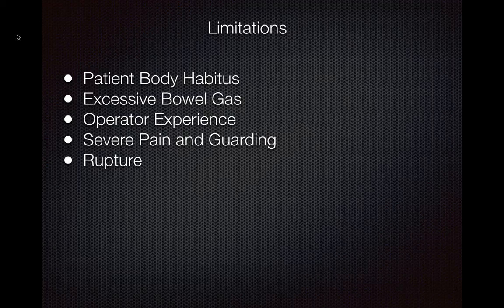And also, it is known that ultrasound isn't as sensitive as CT scan to diagnose ruptured appendicitis, and so just keep in mind that sometimes it can be hard to see the appendix when it is ruptured. There are some criteria in the literature to help us diagnose ruptured appendicitis, but we won't go over them in detail today.